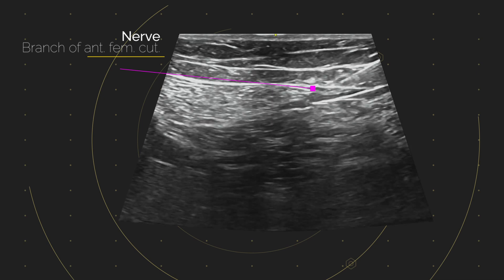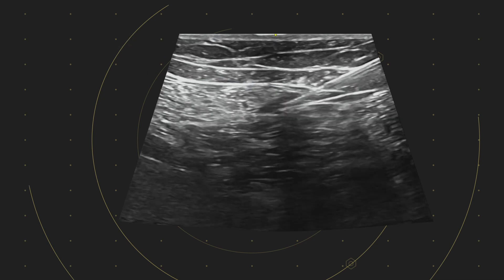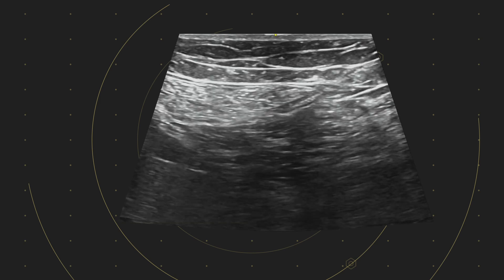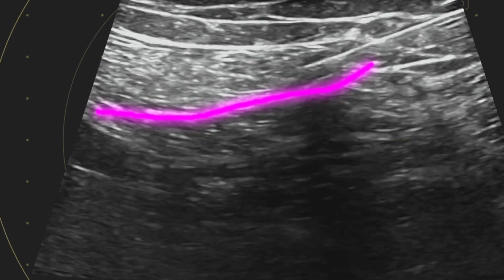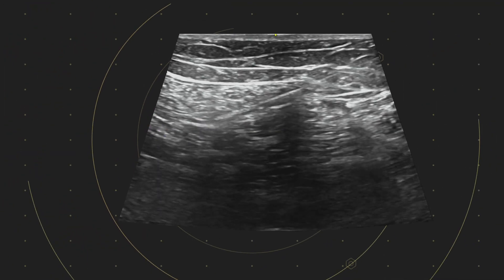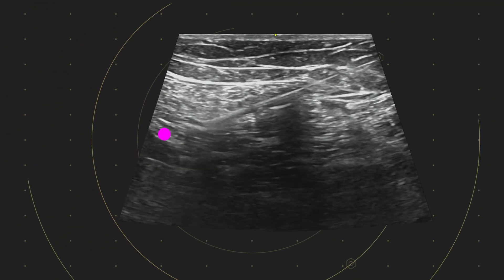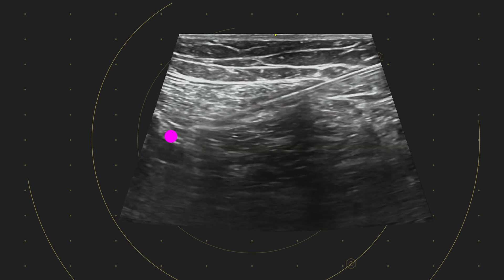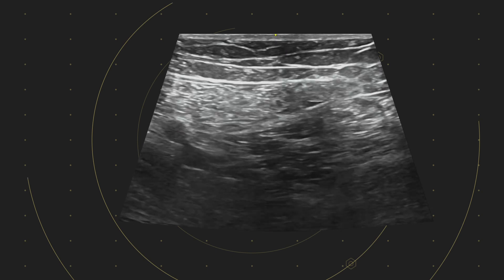As we travel along here, we've got a couple of options. We could hydrodissect a plane open, but we're actually going to stay within the sartorius, above the epimysium of the sartorius. We've sped this up about four times — the needle's moving slowly towards our target. We think this is the saphenous here; a little test injection there. And as we get closer, we're becoming more and more cautious.